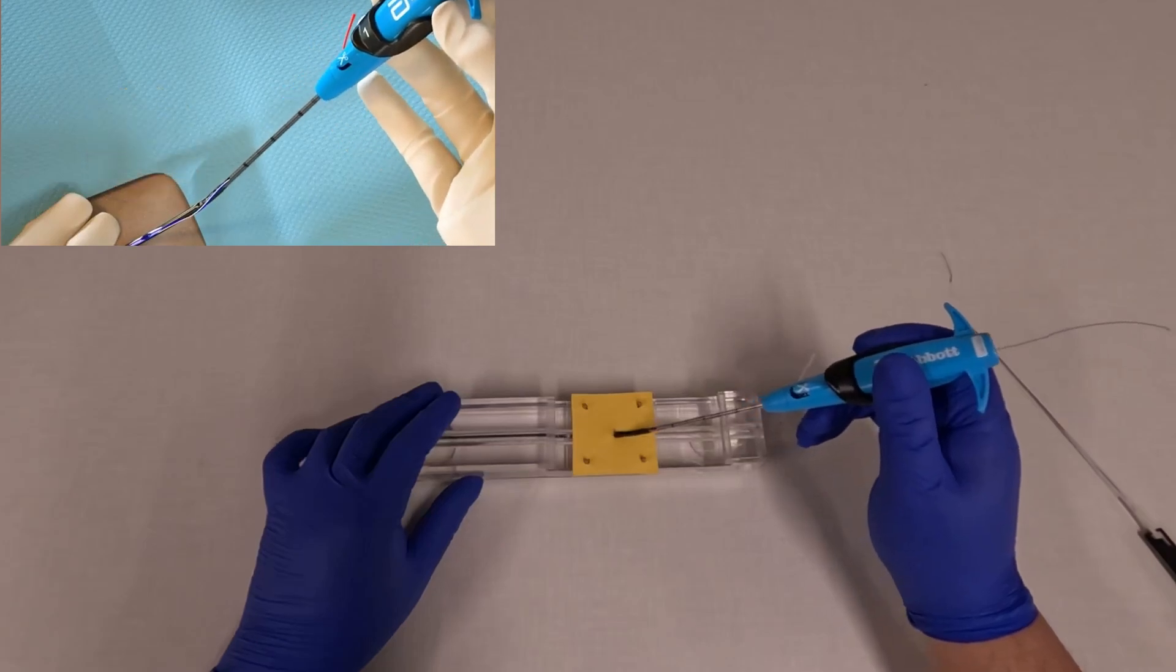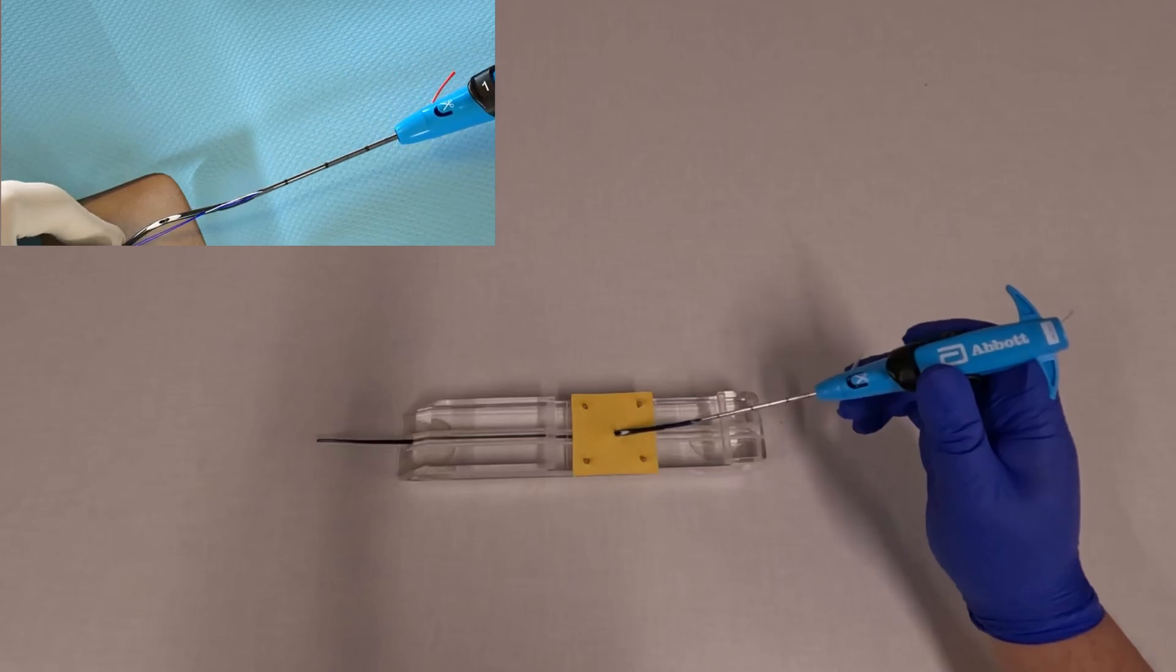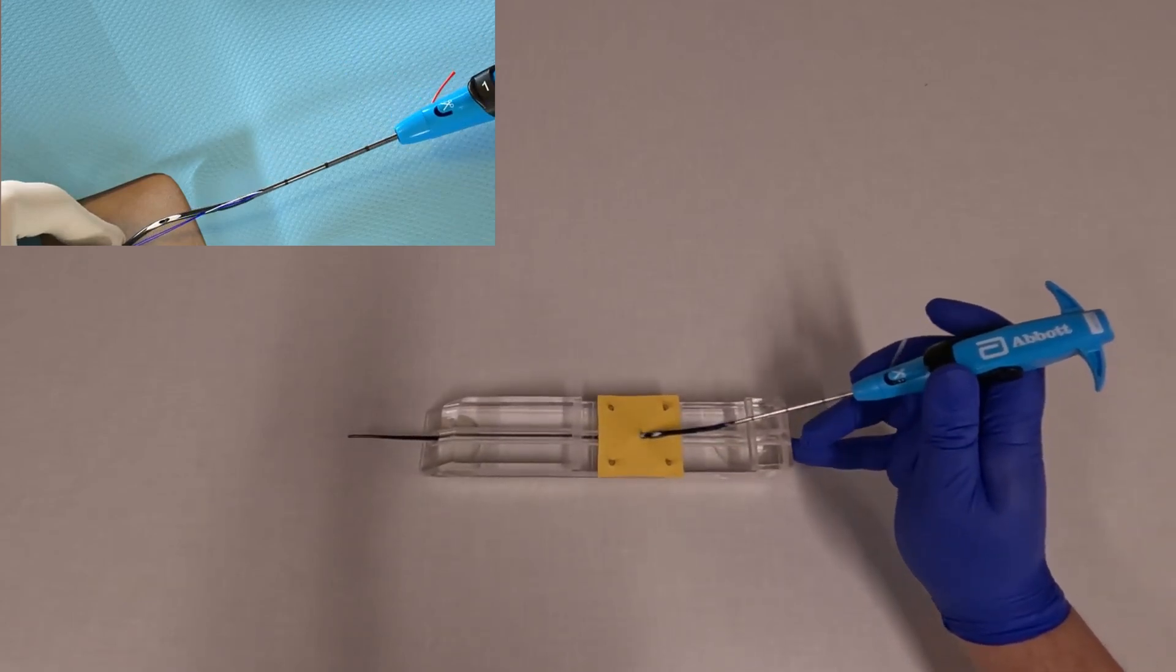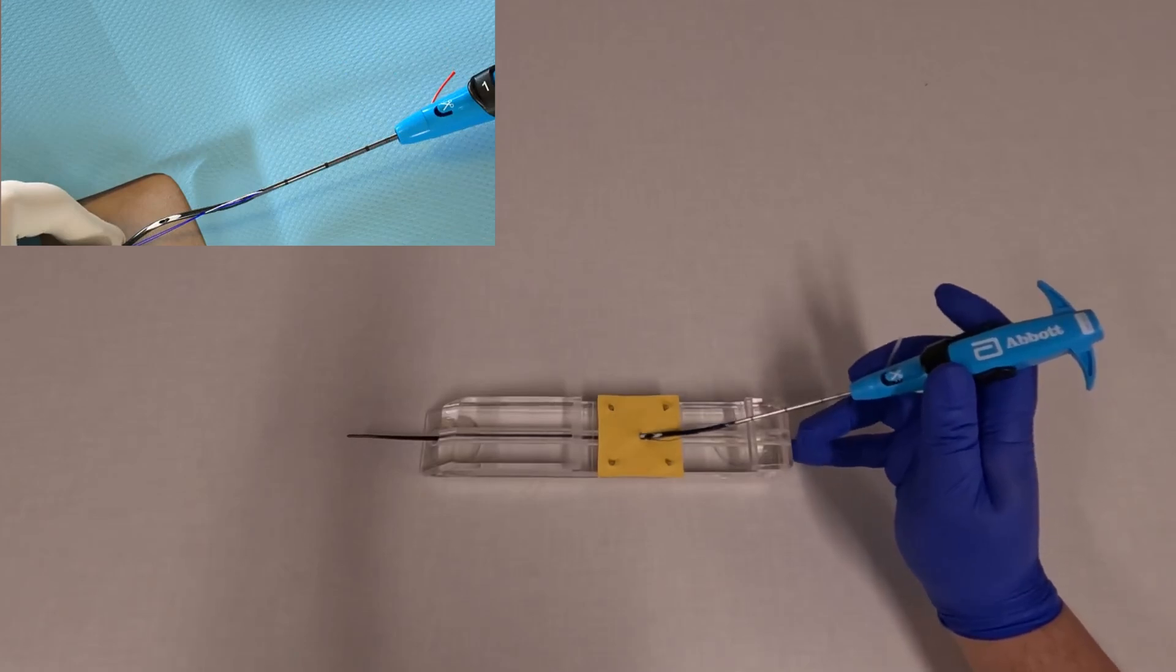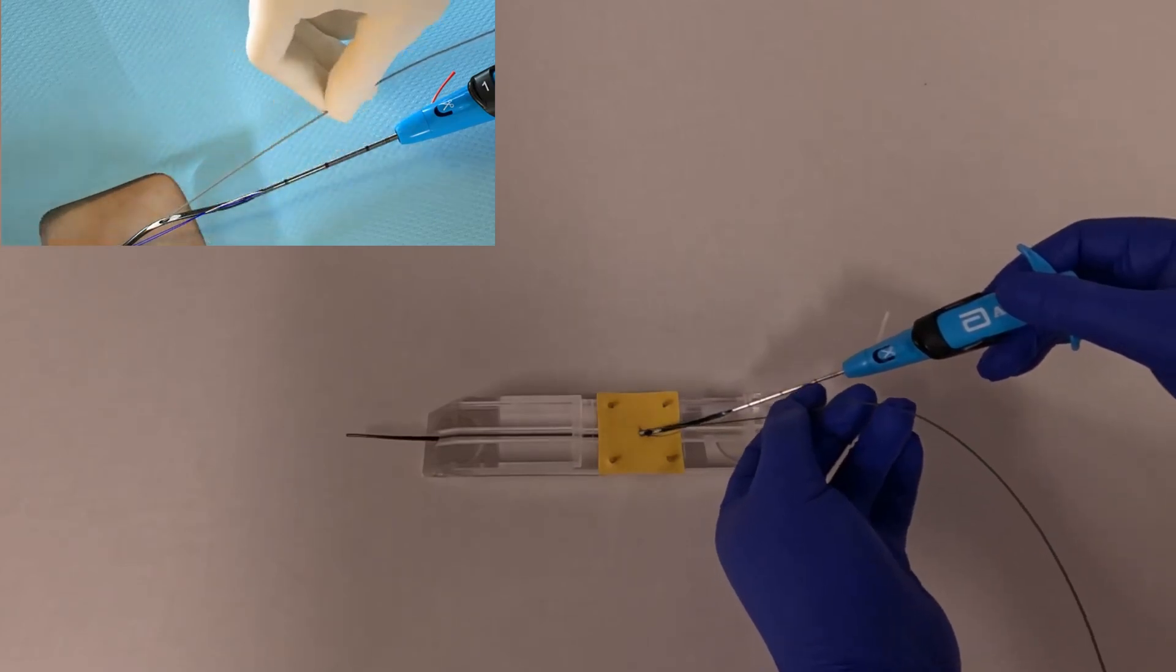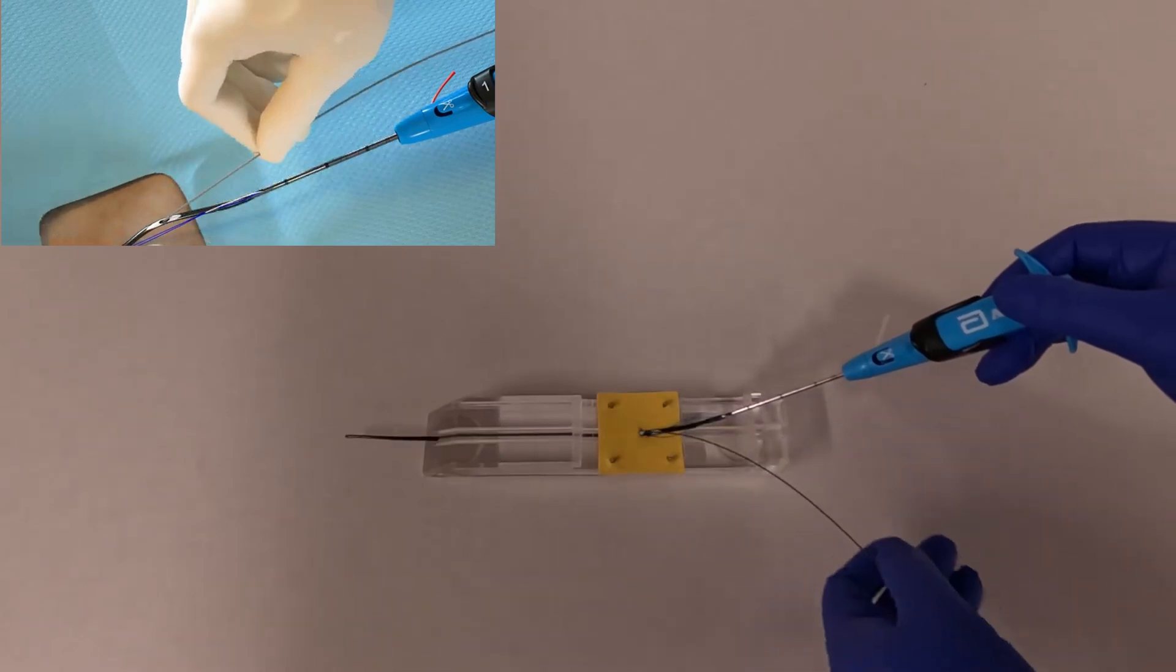Next, we can pull out slightly until the wire access port is outside the skin level. You can feed your guide wire back in. This allows you to maintain luminal access.